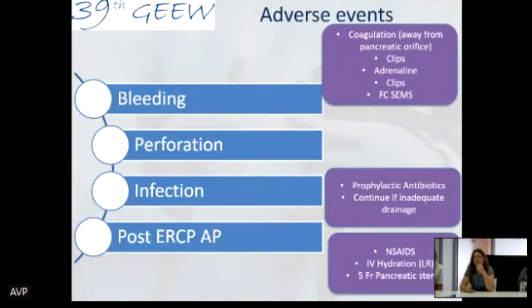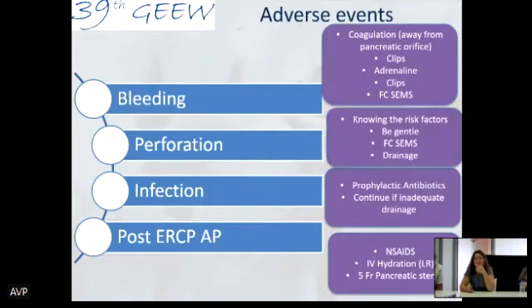And the balloon as well. You can inflate the extraction balloon and just put it there, do a bit of tamponade. You can start with that before doing all the other things. If you can clearly see that it's on the edge of the sphincterotome, you can use your sphincterotome and coagulate, but the balloon tamponade is a good trick.